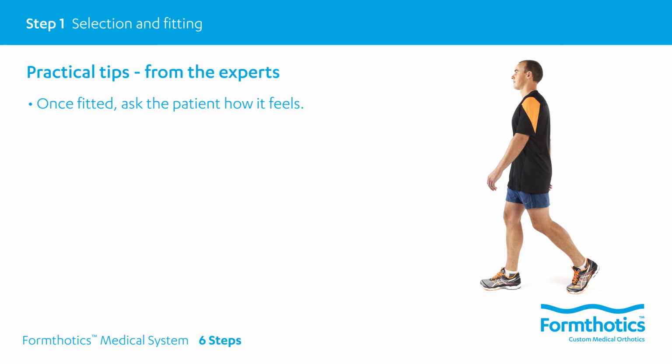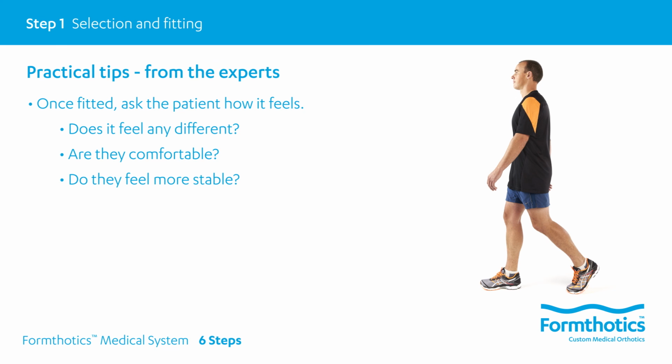Once fitted, ask the patient when walking around how it feels. Does it feel any different? Are they comfortable? Do they feel more stable? Valuable insight into how the patient is feeling can be gained from these questions.